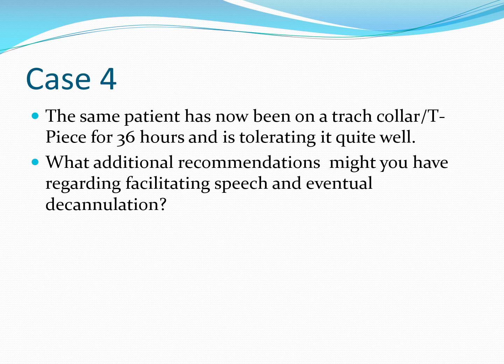Same patient now has been on a T-piece, a trach collar for 36 hours, tolerating it quite well. What additional recommendations might you have for facilitating speech and eventual decannulation? So a few things, certainly the speaking valve. We've talked about that. We've talked about perhaps switching them to a fenestrated tube, downsizing them, maybe going from an 8 unfenestrated to a 6 fenestrated.